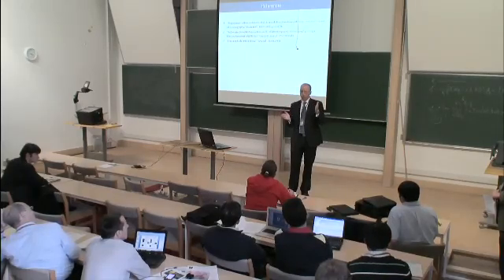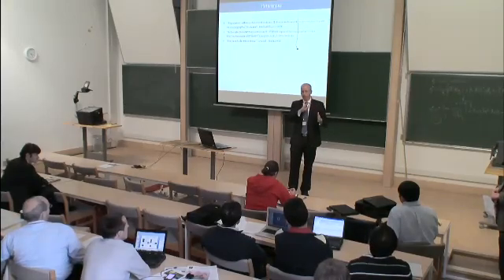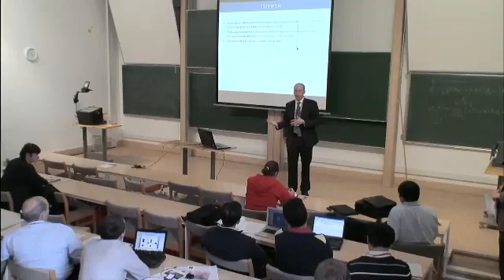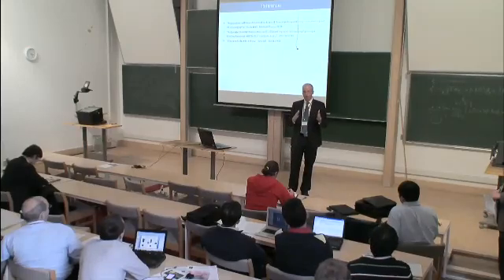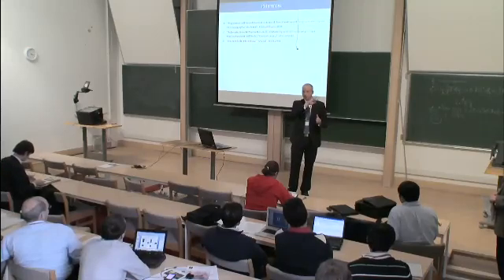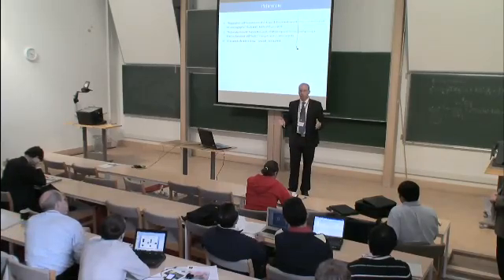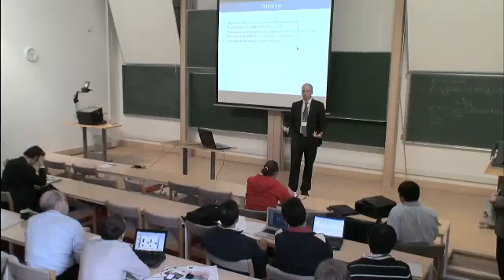The length of the colon and the things along it are of interest, but if the colon is moving up or down, that isn't of real value in our problem. With standard medical imaging techniques, it's difficult to reason about the shape of the colon. So we conformally map it onto a plane, which takes out that degree of freedom, reduces the complexity of the problem, and gives us a solution.